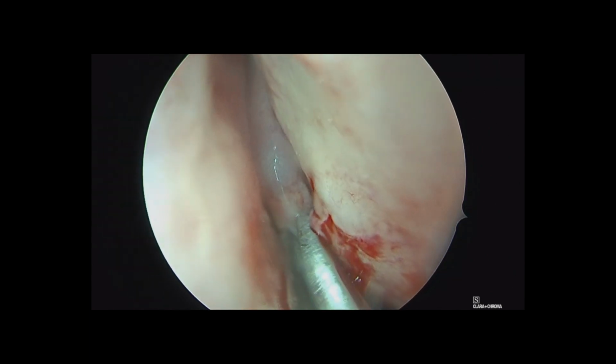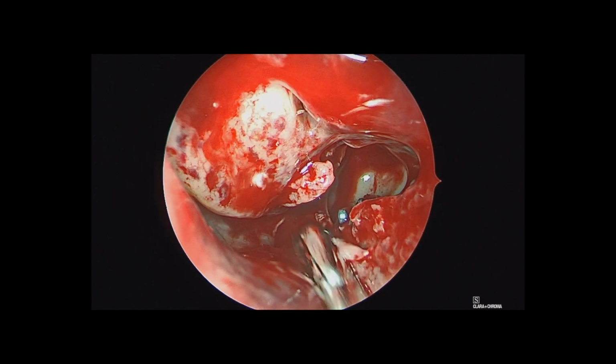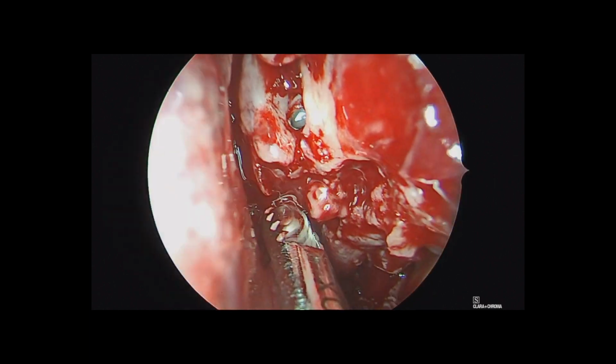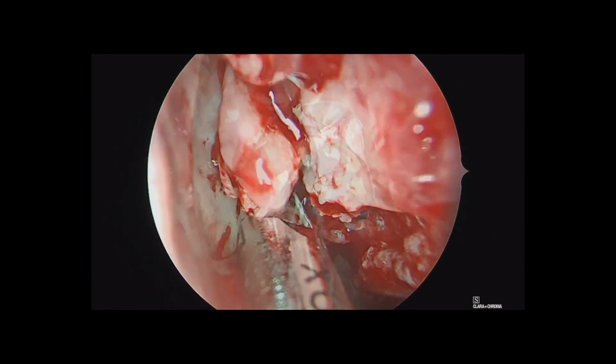Once we've resected this back towards the pterygopalatine fossa, we'll then go endonasally and perform a left-sided maxillary antrostomy, as you can see here, with an uncinectomy, and then addressing the ethmoid bulla and doing our ethmoid sinus work through this area.